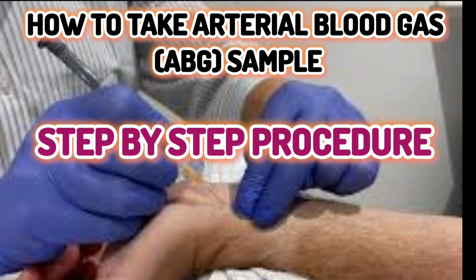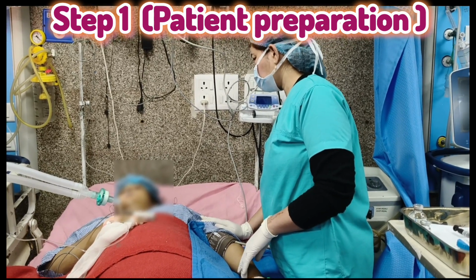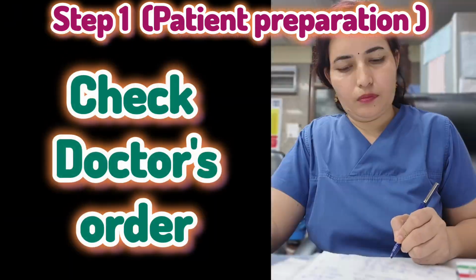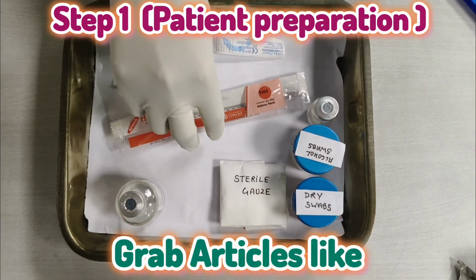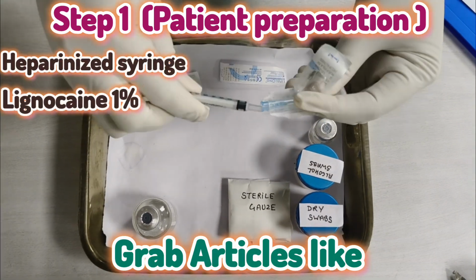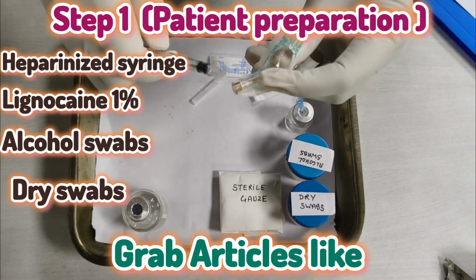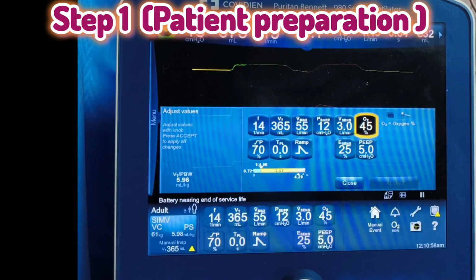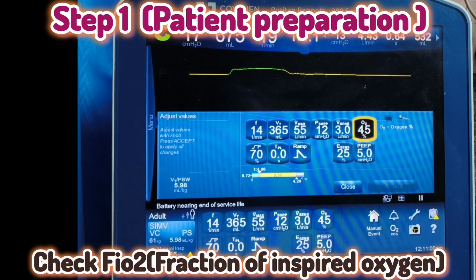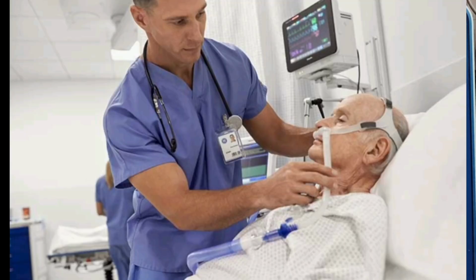How to take an ABG or arterial blood gas sample, step-by-step procedure. Step 1. Patient preparation. Explain the procedure to the patient. Check the doctor's order. Wash hands and wear gloves. Keep all articles ready like heparinized ABG syringe 1 to 2 ml, alcohol swabs, dry swabs, gloves, and an ice pack if there is a delay in sending the sample. Check the patient's oxygen status. Note FiO2, the fraction of inspired oxygen, and the oxygen device.